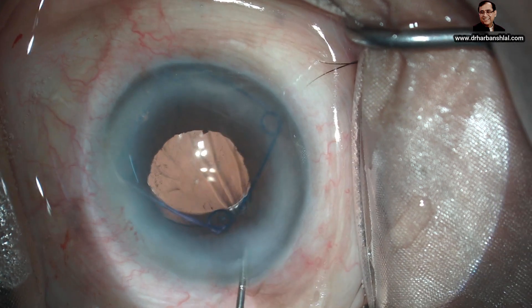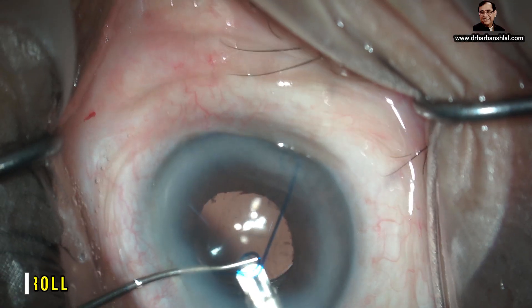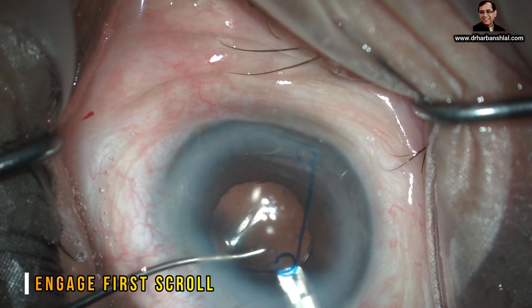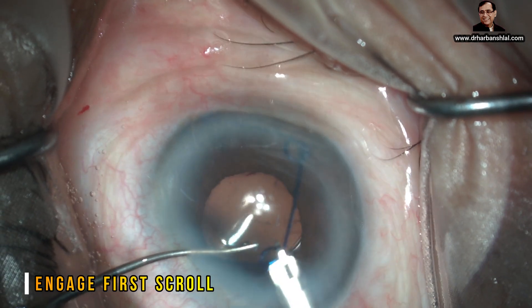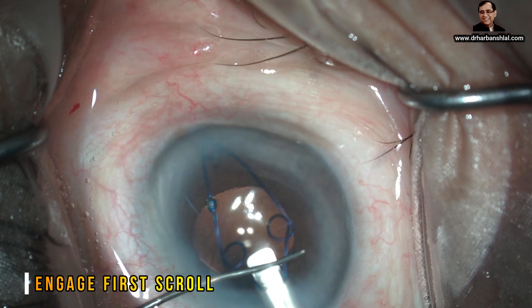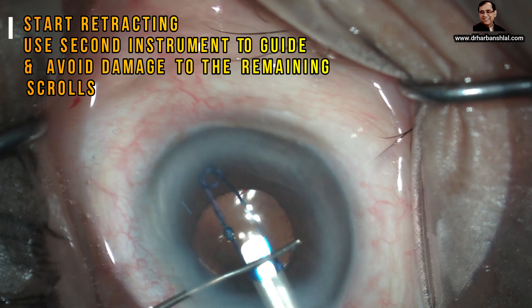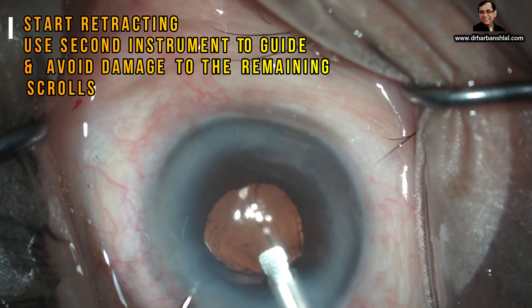Now all the scrolls have been released. Take the barrel inside — one of the scrolls is kept on top of the plate and is hooked inside. While pulling or retracting it into the barrel, use the second instrument to guide it.